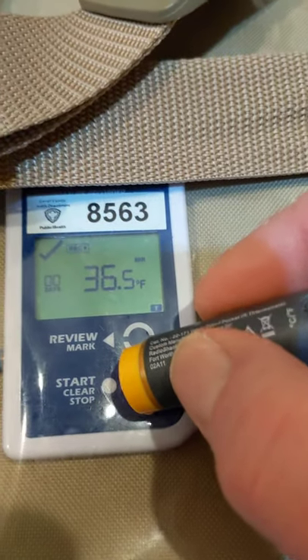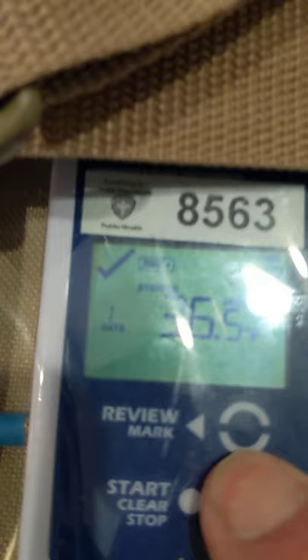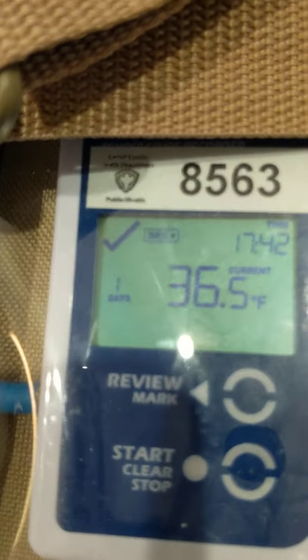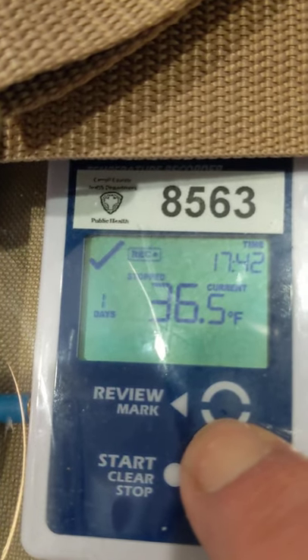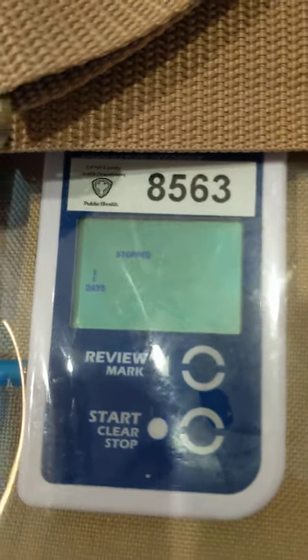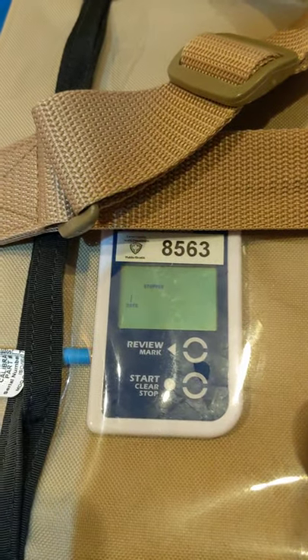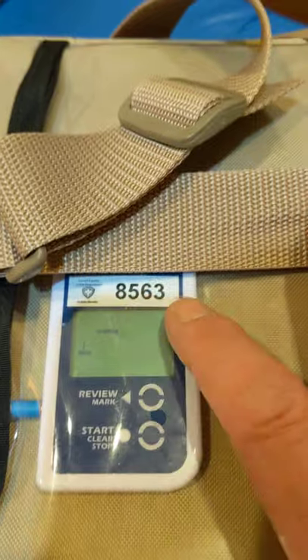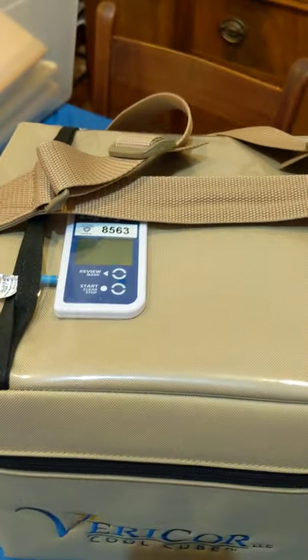Now I'll finish setup by holding down the stop button. Push down — you see that it starts flashing 'stopping,' then it says 'stopped.' Once it does that, let go of it quickly and it is actually stopped. That is to prevent accidental stops in case somebody leans on the button. When you return this, make sure any information for your clinic uses the last four digits of the log tag and the name. This is going to be Cool Cube 1, and I'll put a sticker on here to label it as Cool Cube 1.